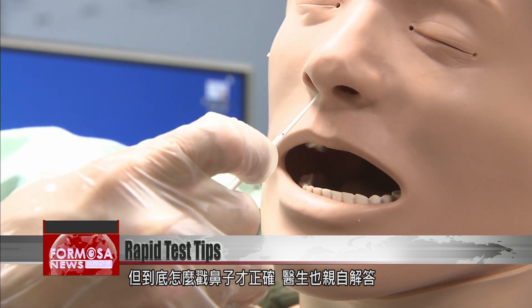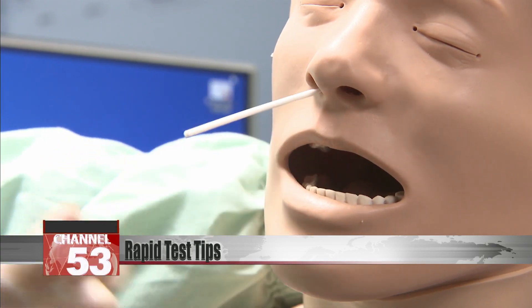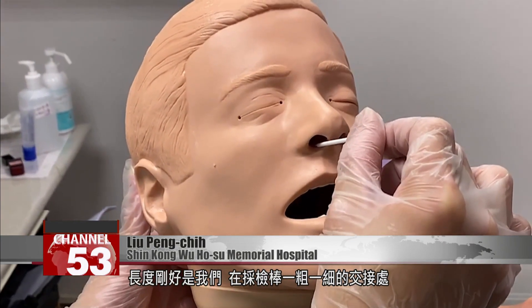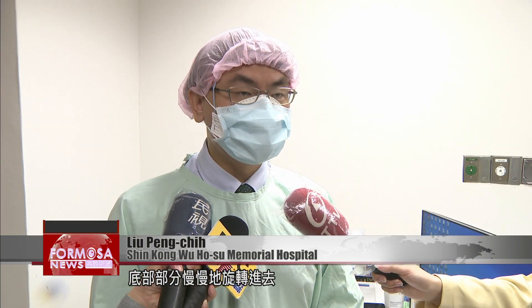Dr. Liu Pengchi has this advice on how to correctly get a sample. Usually when you insert the swab, you'll feel some resistance. The distance is more or less the point between the thick segment and the thin segment on the swab stick. You put it in slowly, rotating as you go.